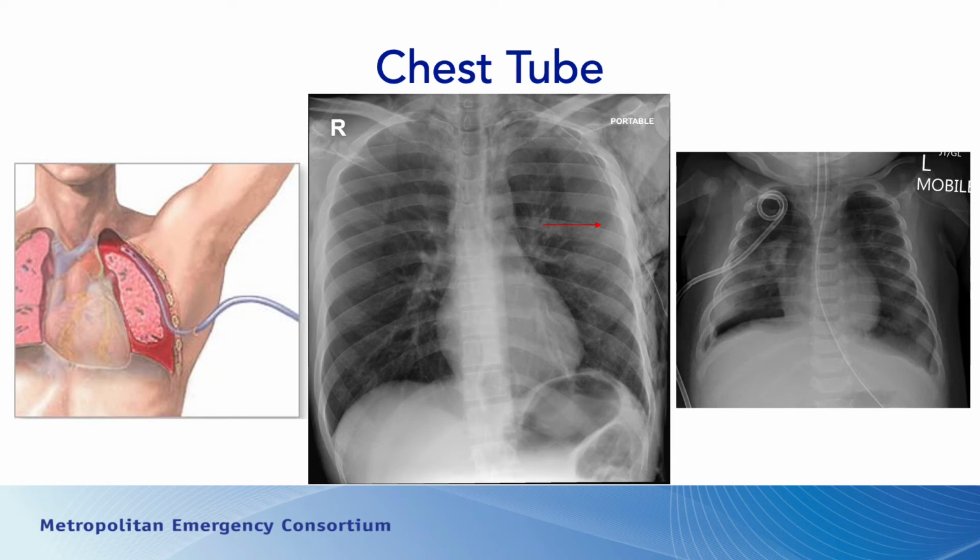Typically, these tubes are hooked up to either a chest tube container, which has suction, or they can be hooked up to a flutter valve or a Heimlich valve, so that anytime the patient coughs or does a Valsalva, air is forced out, and the flutter valve lets air out but won't let air back in. So these chest tubes are always hooked up to something.